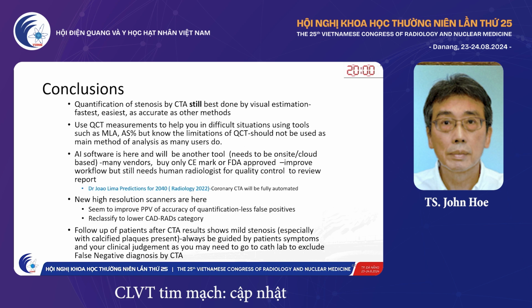AI software is here and will be another tool, needs to be on-site and cloud-based. Many vendors available, buy only CE mark or FDA approved, improves workflow but still needs human radiologists for quality control. The high-resolution scanners are here, seem to improve positive predictive value of accuracy of quantification, less false positives, and can reclassify patients to a lower CAD-RADS category.